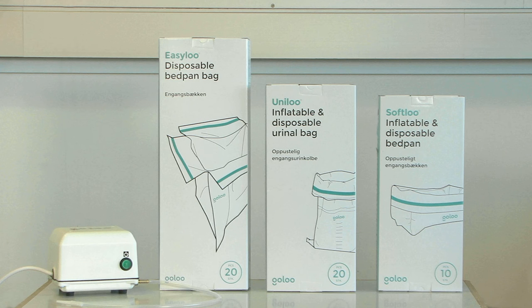GoLoo also offers two other disposable products: UniLoo, which is an inflatable urinal bag, and EasyLoo, which is a bedpan bag for a commode chair. Check them out on GoLoo.com.